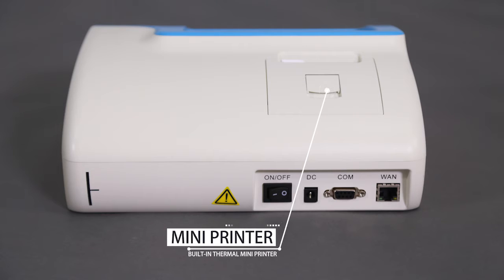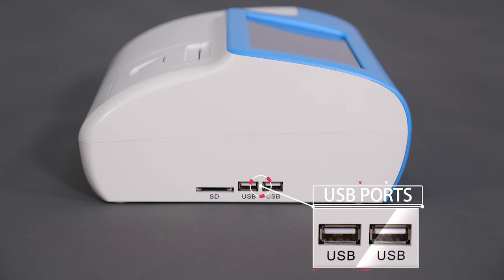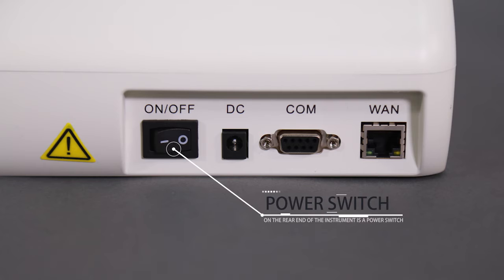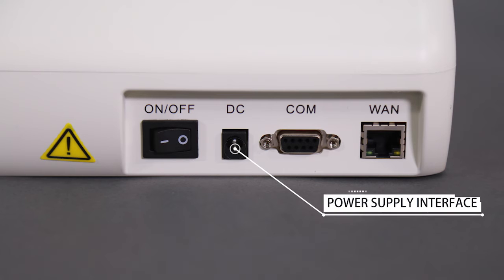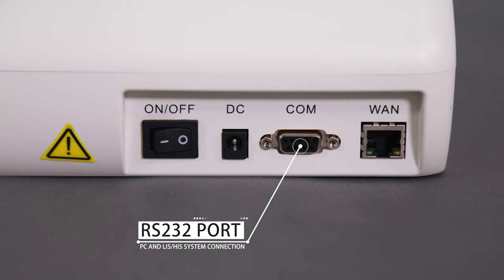There is a built-in thermal mini printer to print testing results. Two USB ports on the left side are used to upgrade the system and to connect with an optional barcode scanner. On the rear end of the instrument is a power switch, a power supply interface, an Ethernet port, and an RS232 port for PC and LIS-HIS system connection.